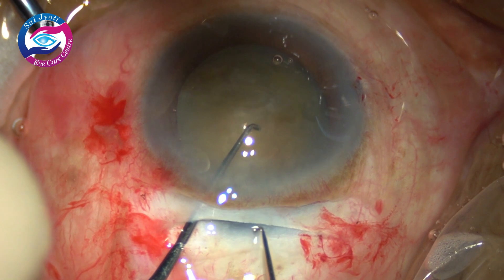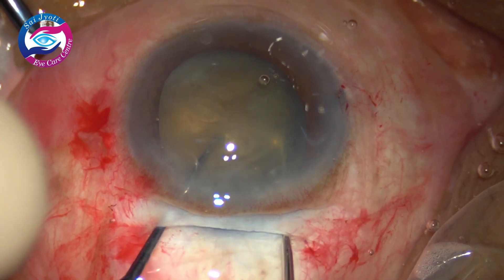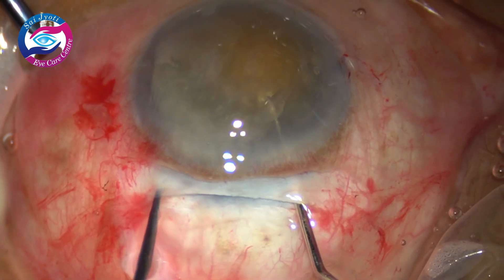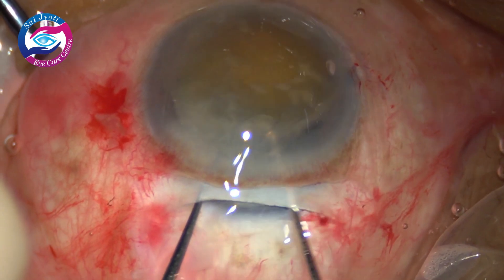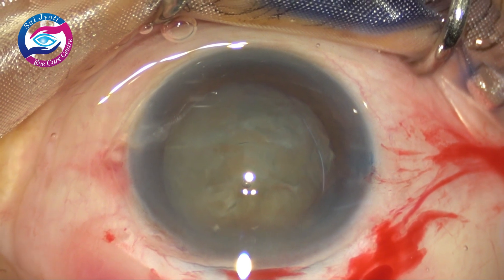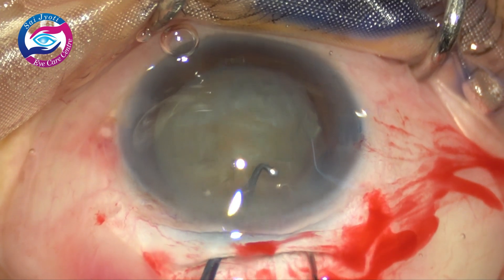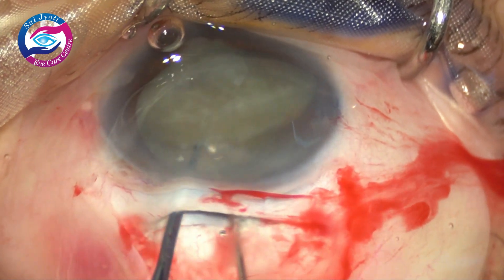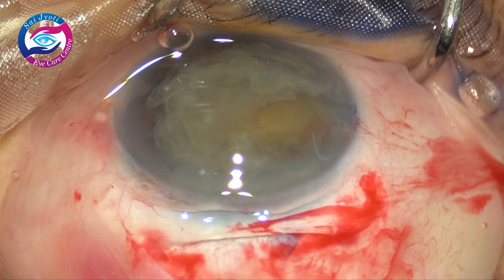One more case: the left Sinski pushes the nucleus slightly downwards and the right one goes under the entire capsular margin and wheels out the nucleus so easily. Even the biggest nucleus with zonular weakness can be wheeled out so easily without causing any stress to the capsular bag. This is a very hard grade nucleus — the incision should be of the appropriate size, 5.5 to even 6 mm. Again the same technique is employed: the nucleus is slightly pushed downwards and the other Sinski hooks the equator and it is wheeled out of the capsular bag. One can notice the size of the nucleus.